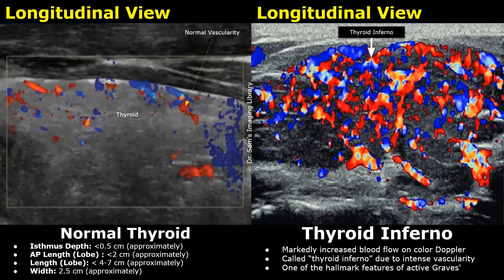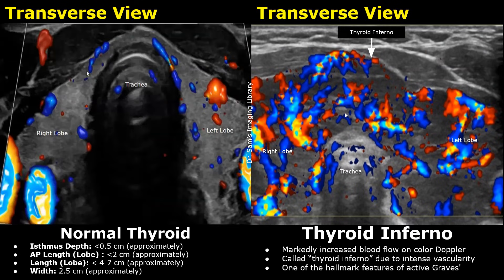Thyroid inferno refers to significantly increased vascularity on color Doppler. These are longitudinal views showing the thyroid gland. Normally, we will not see many color Doppler signals in the thyroid gland. But in Graves' disease, in a thyroid inferno, we see lots of color Doppler signals in the gland. This image shows the normal blood flow in the thyroid in transverse plane. The thyroid inferno refers to the intense vascularity in the thyroid on color Doppler. The thyroid appears enlarged and seems to have a hypoechoic and heterogeneous echo texture.